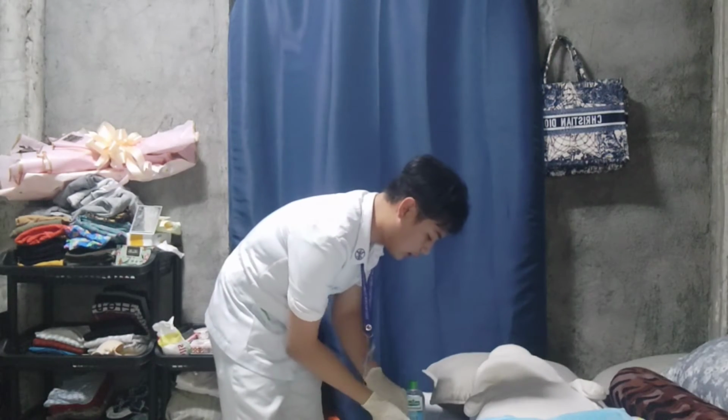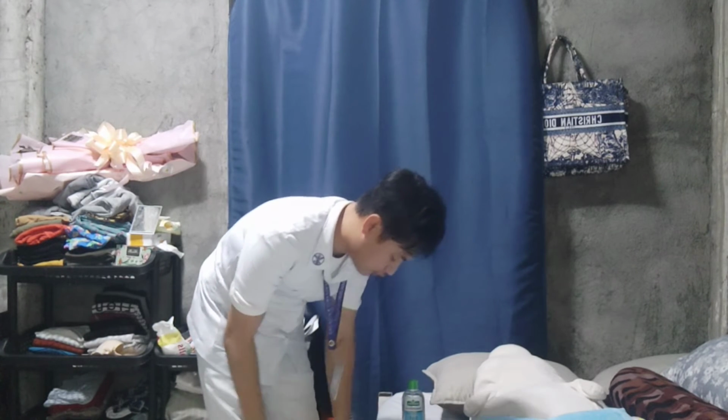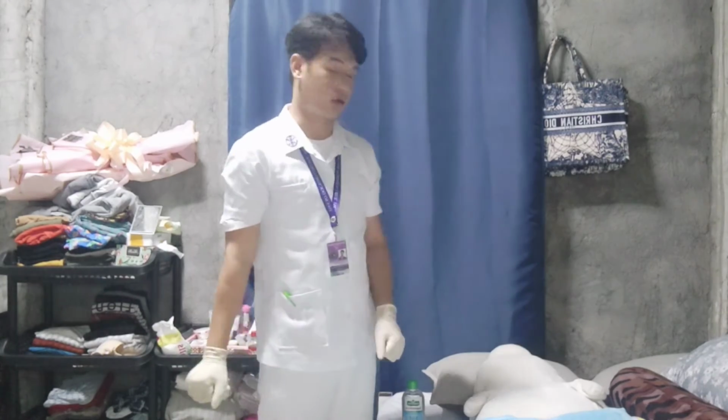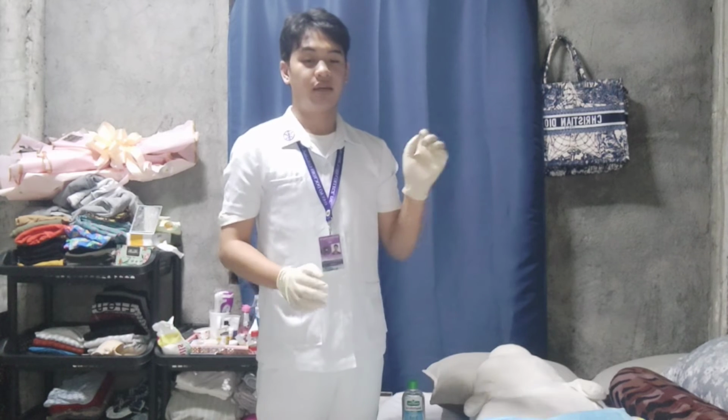Next is we need to discard the injection. So, dispose the supplies appropriately in the proper receptacles to eliminate the chance of others being pricked with the needle syringe. So, I discard the needle already. So, assist the patient into a comfortable position and jot down the medication ticket if not using the EMR. So this is to promote the patient's comfort.